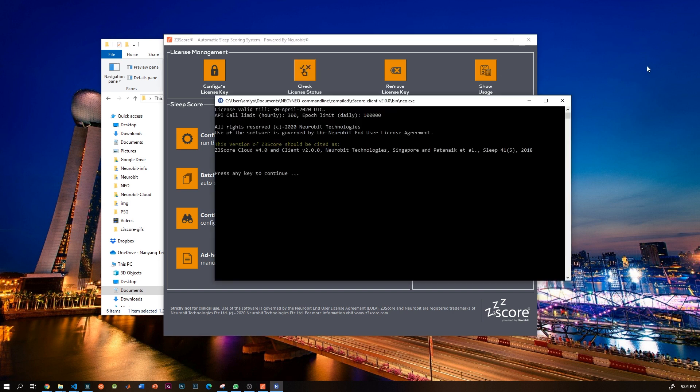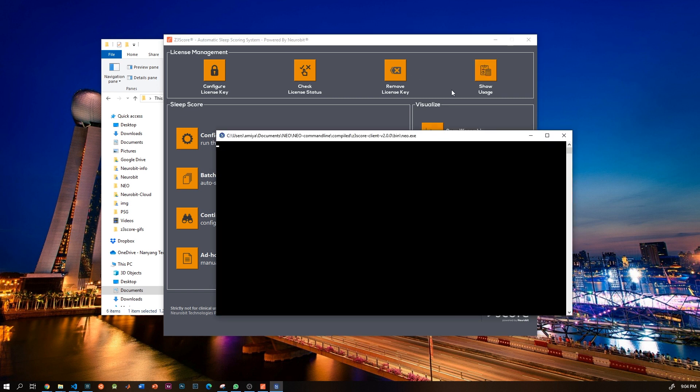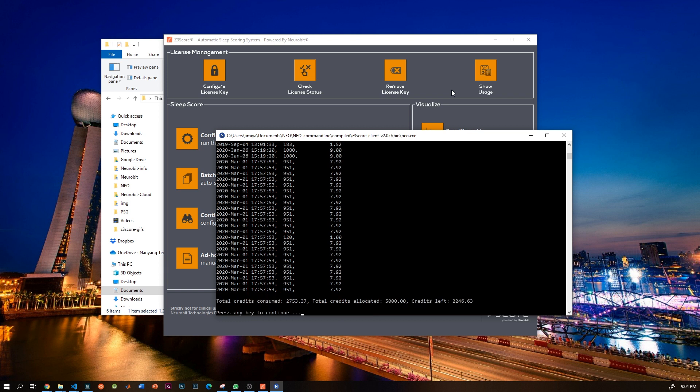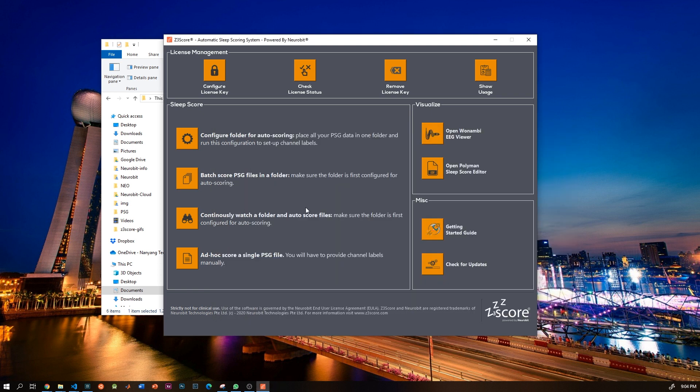You can check your license status by pressing check license status. So here you can see my license expires on 30th April 2020. You can click remove license to remove your license, which I am not going to do. Press show usage to see your usage level. You can see these are the number of credits left for me.